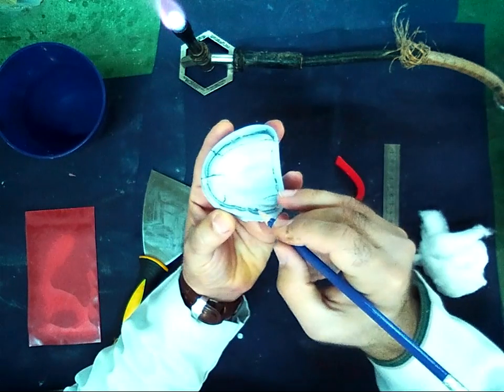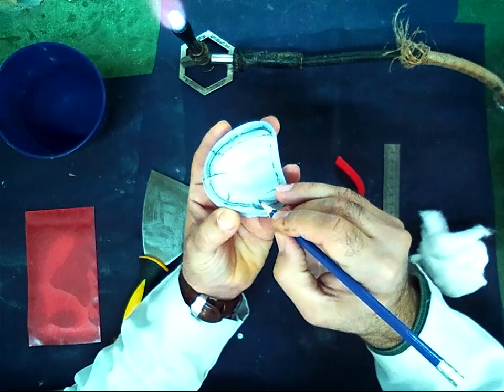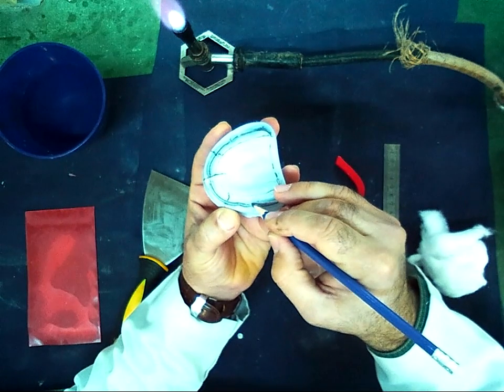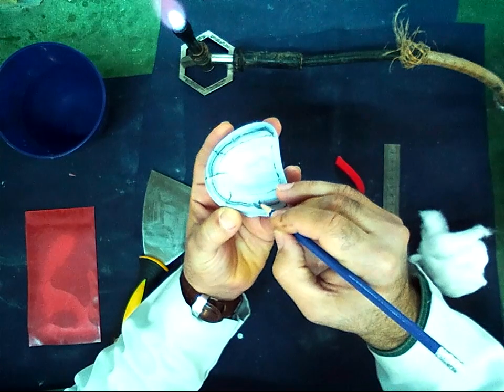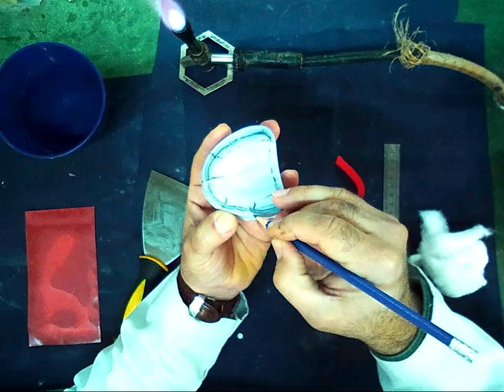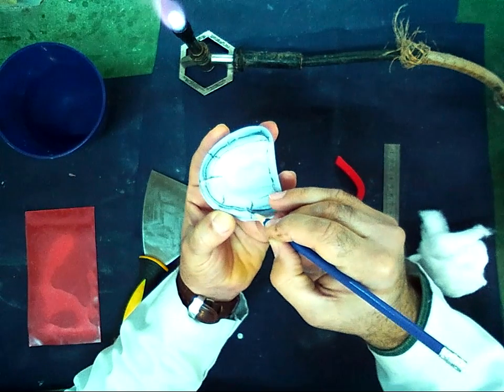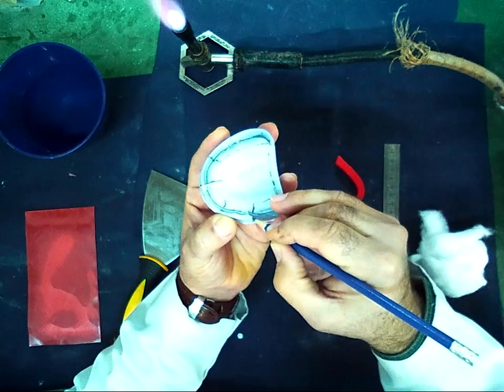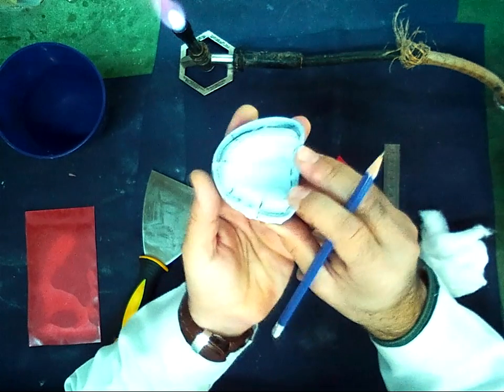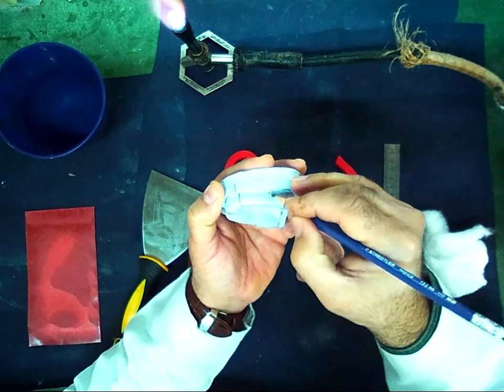The fourth line, I draw it in the molar region, first molar region, just behind the buccal frenum. And on the other side, I draw it also.